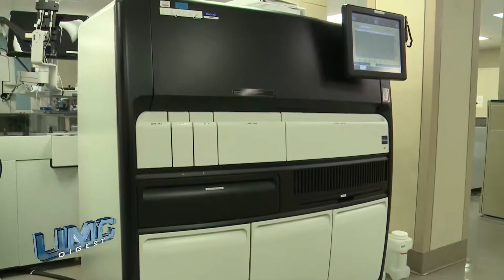PCR test indicates that the patient is positive and is shedding the virus. The antibody test indicates past exposure or previous exposure of some kind. And if you develop antibodies to the test, then we know that at one point that you had the virus and might have been asymptomatic. And a lot of people are very interested in that because they believe they may have had it at one point, but didn't really have a lot of symptoms. And so this is an opportunity, if they had the antibody test, to determine whether they have had previous exposure.